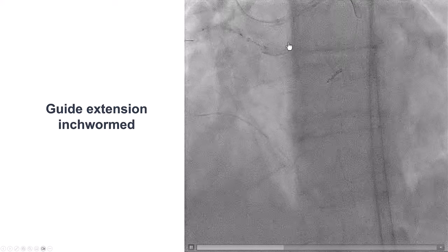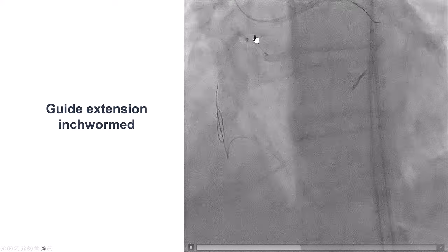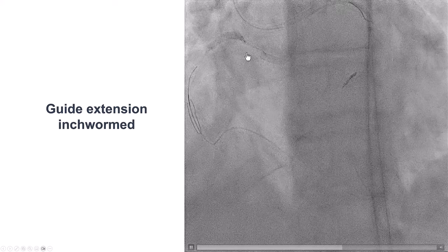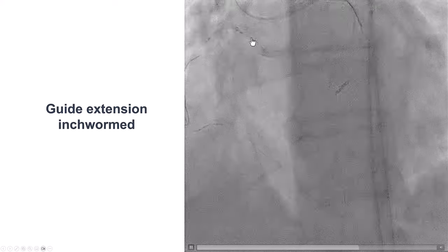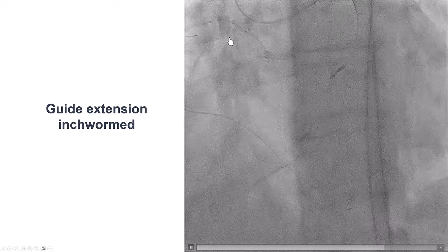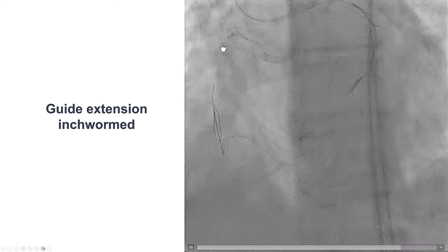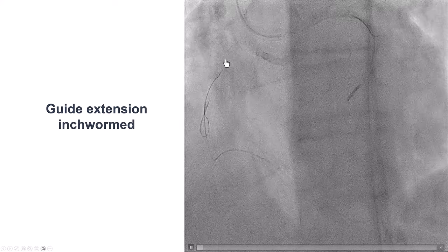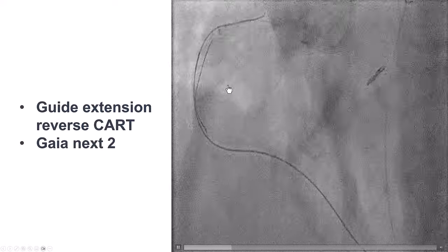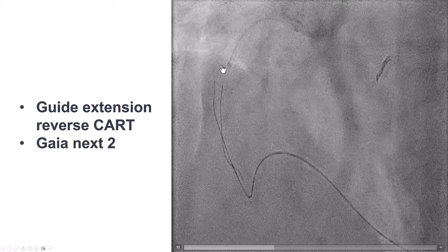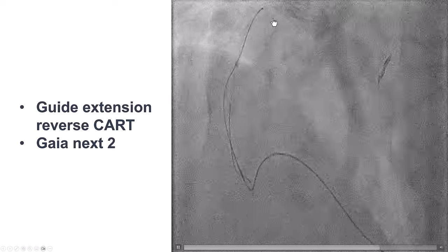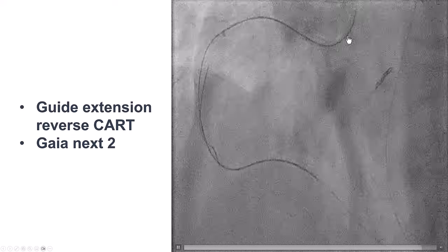We advanced the guide extension further using the inch-worm technique — balloon inflated, deflated, then the guide extension advanced — which was very useful for achieving the reverse CART technique. We advanced to the mid-RCA and were able to advance a retrograde wire after multiple attempts. This was a Gaia Next 2 inside the antegrade guide extension. We then externalized an R350 wire.